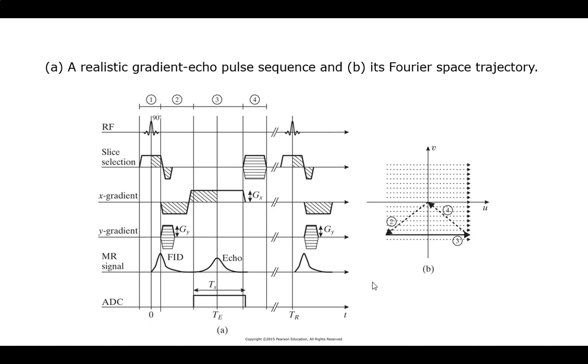And remember that time is money on this type of equipment. These things are really tens of millions of dollars. The more people you can go through, the lower the cost, which means the more economic it is for those people getting an MRI scan. It also, people have problems, it's scary for most people in those tubes. They're scary, they're loud, the magnets clicking to do all this.